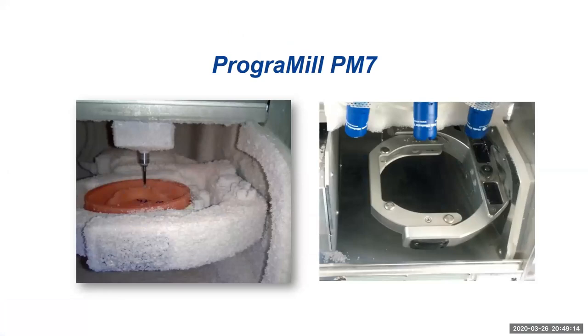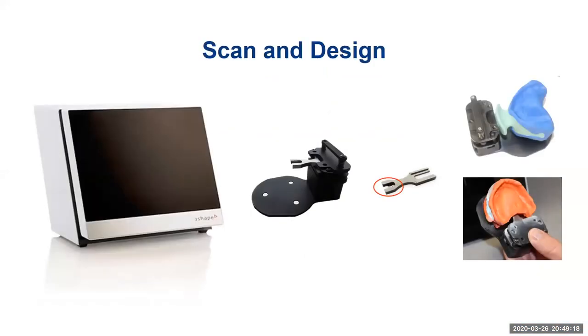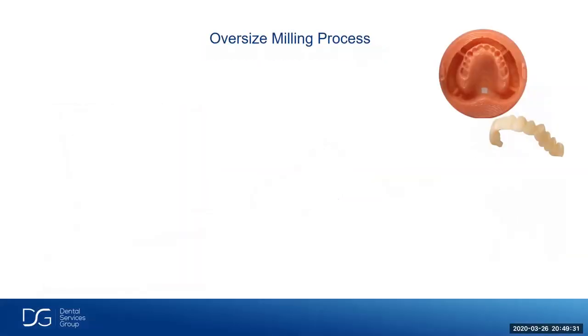Very accurate milling. And then on the milled denture workflow, pretty much what we talked about earlier: we're scanning and designing, putting the information from that scan into the software, designing and printing that try-in, and then milling the final denture. But we also have something called the oversized milling process, and this is utilized when we're milling our denture teeth instead of using individual denture teeth.